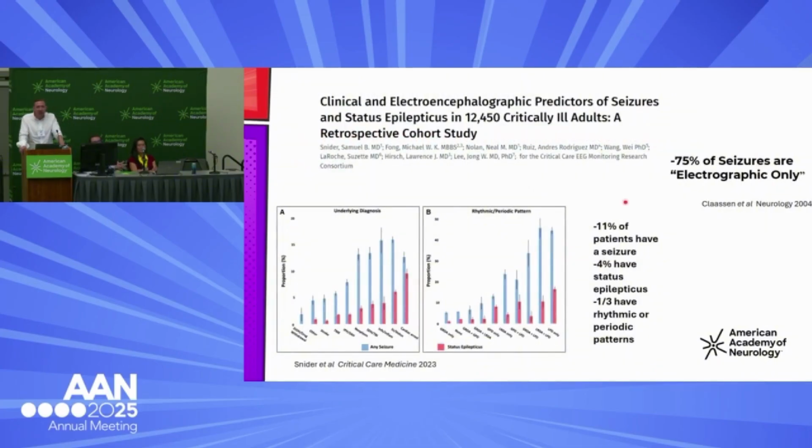All right, so first, how common are these things? We started to do a lot of digital EEG in the late 90s, early 2000s at select centers, largely in the US. When you started to see these initial studies published, there were very high rates of seizures associated with hooking up an EEG to somebody with altered mental status or some kind of paroxysmal clinical event in the ICU. But now, there are a lot of centers that have started using this quite broadly. And we have gotten rid of a little bit of that selection bias, and I think we have a better idea of exactly how common these kinds of patterns are in the ICU.